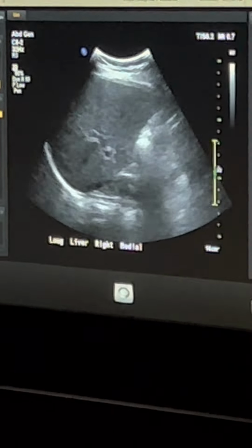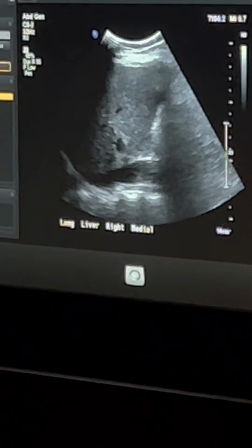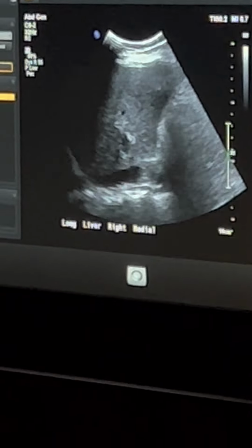And the one other thing, and it's not on right now, but you need to scan your liver with harmonics. Oh, whoops. It's on the screen. Oh, touch screen.